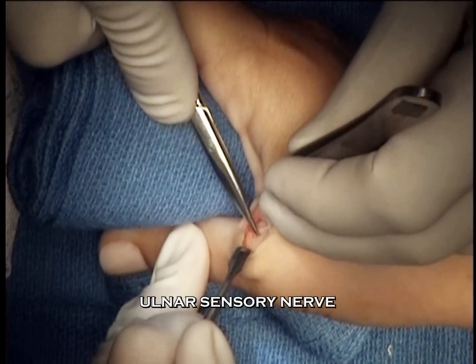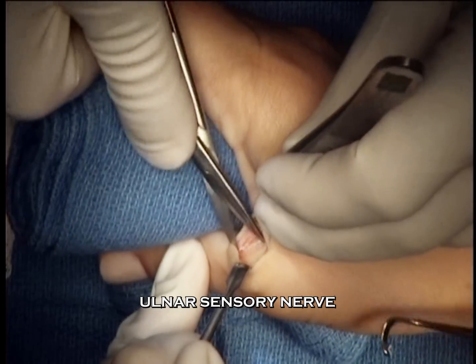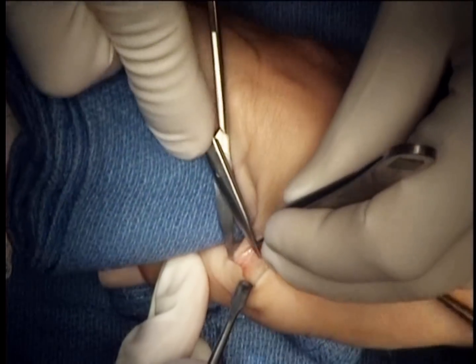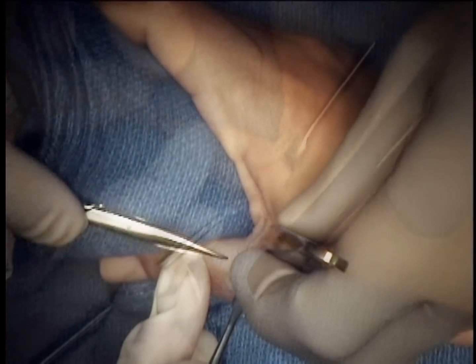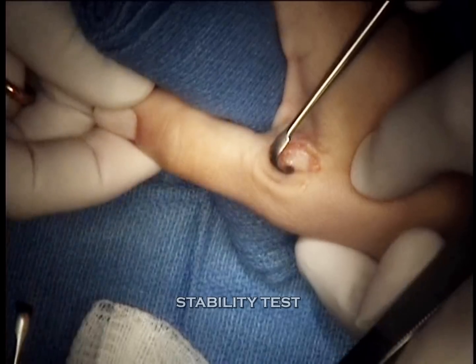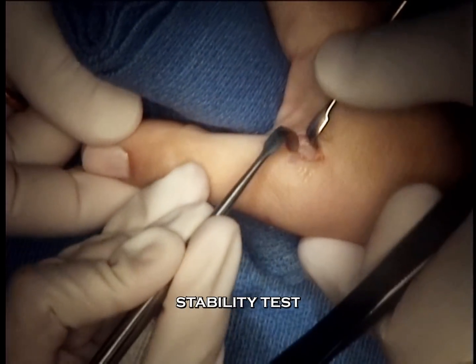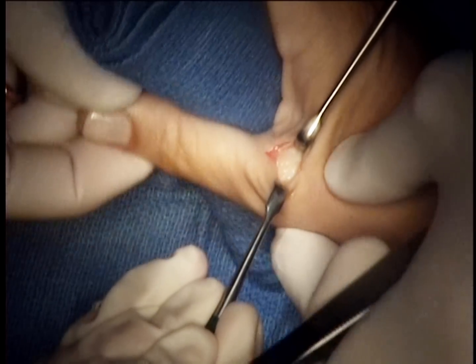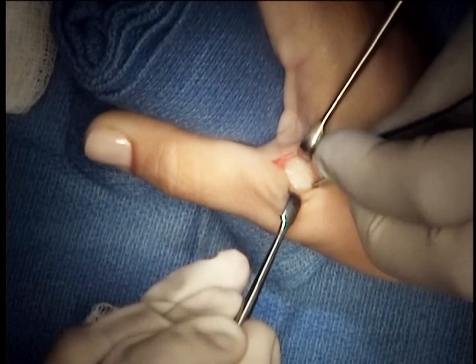Here we protect and dissect out the dorsal ulnar sensory nerve, retracting it to the palmar side. We note the marked scarring of the adductor aponeurosis and the laxity to ulnar-sided stress, consistent with the detachment of the collateral ligament.